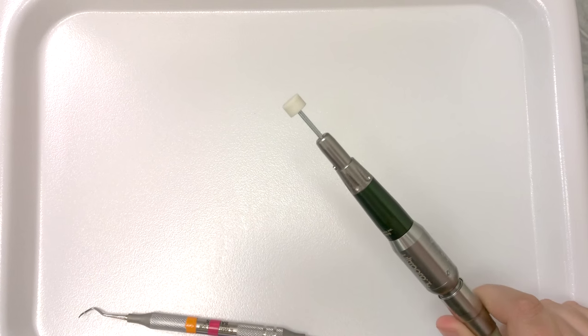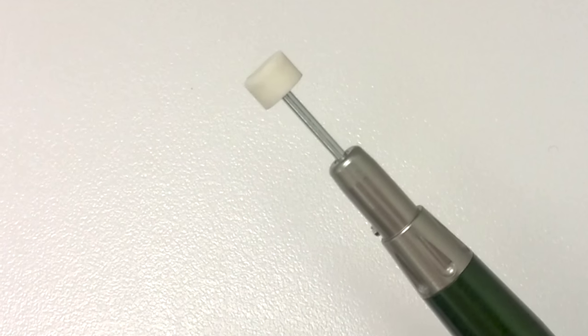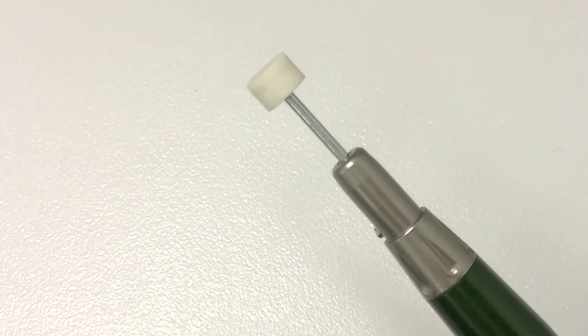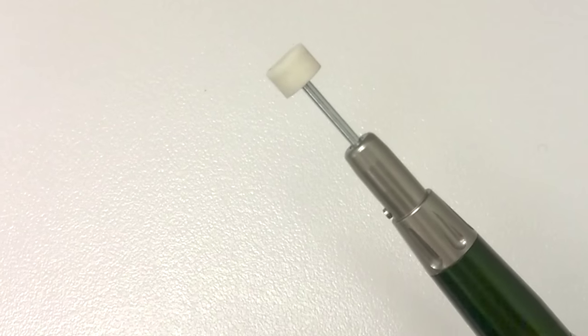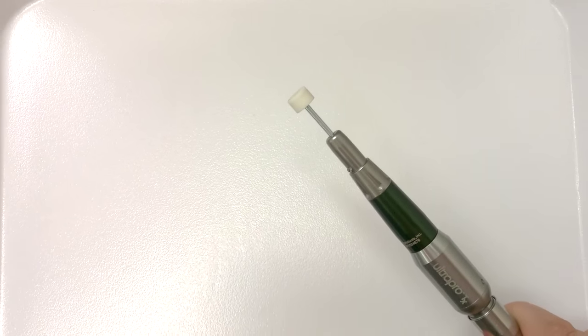If you notice on your white sharpening stones you're getting grey streaks, how to prevent that is you just submerge it in water for one minute before you start sharpening. Honestly though, the grey streaks aren't going to hurt the integrity of the stone, it's just to help with the aesthetics of it.